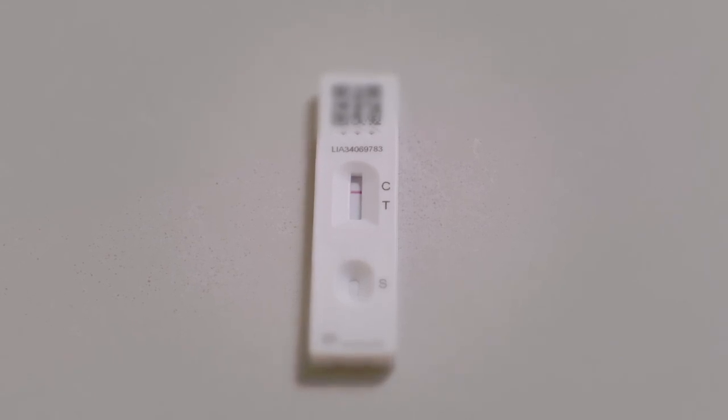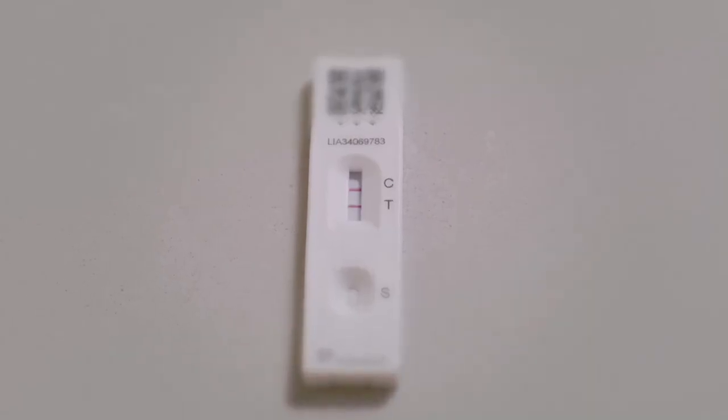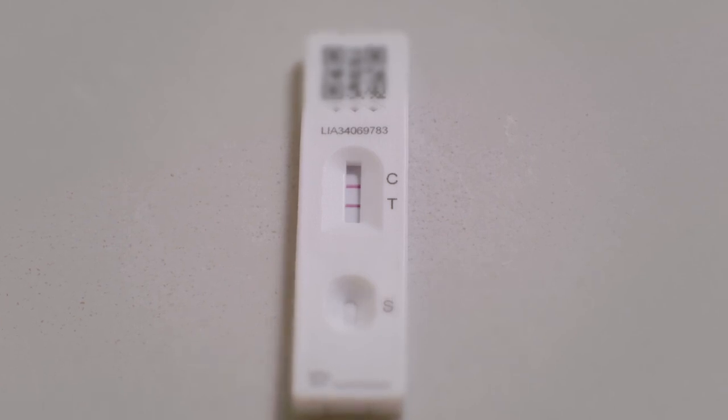At 30 minutes you will see a result on the test strip. You must read your result at 30 minutes and no later. If there is one line next to C and no line next to T, your test is negative. However, you must continue to follow all other guidance in place to help protect you. If you have two lines — one next to C and one next to T — your test is positive.